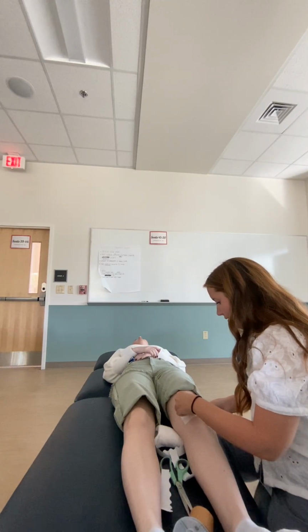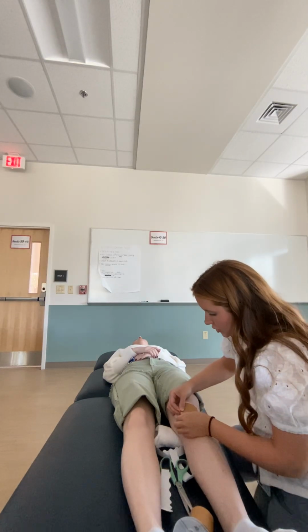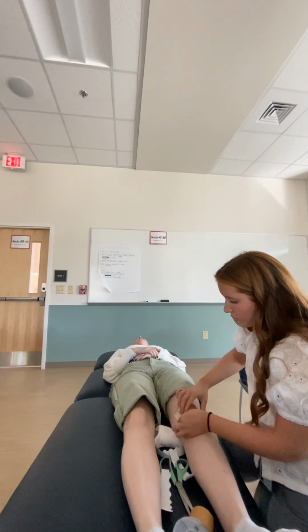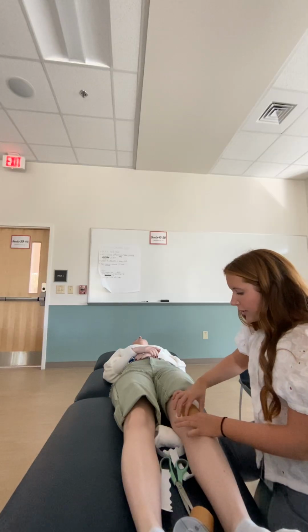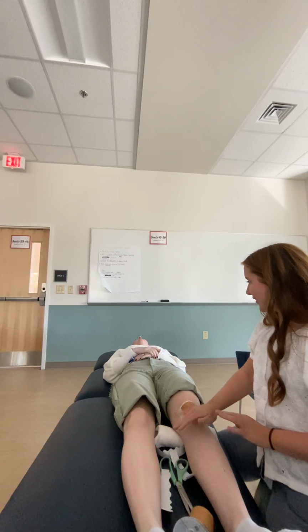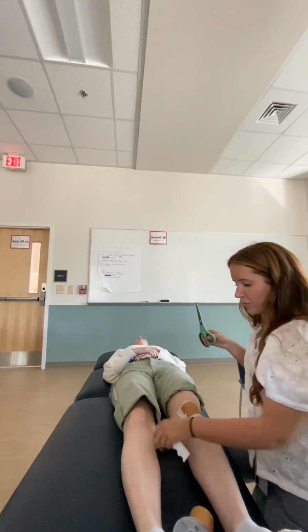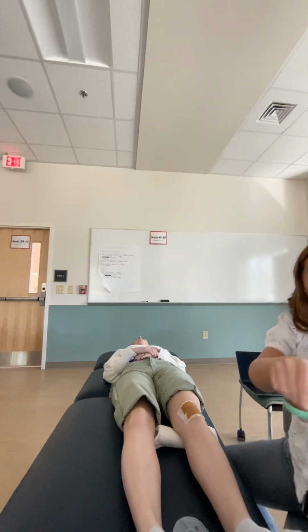We're gonna go about 3/4 of the way on that other piece again, and just apply the force in that medial direction to try to hold your kneecap in place. Does it feel weird? It feels good. Okay. Now I'm gonna move all this stuff out of the way.